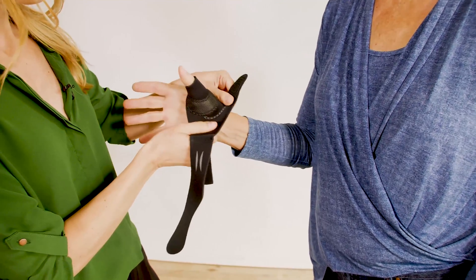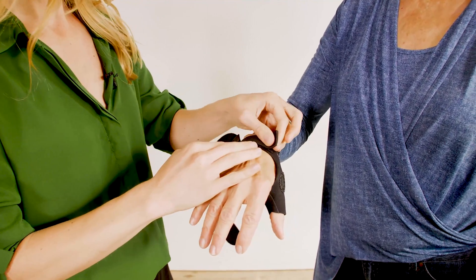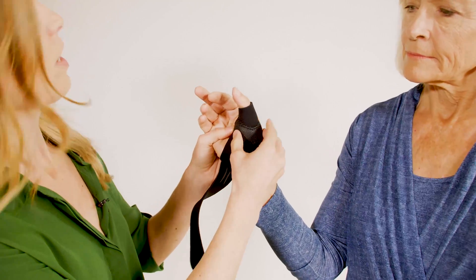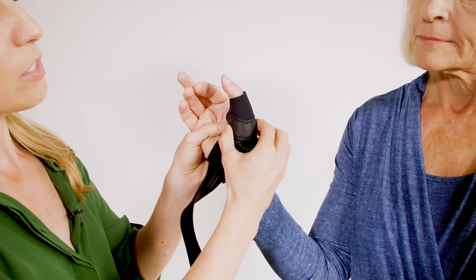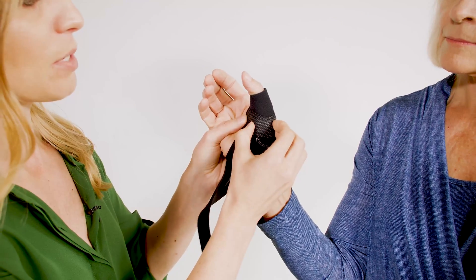Next we're just going to place the thumb into the thumb hole, and close this simple patient closure strap over the back of the hand. Then come through and give a squeeze to the stay so that it kind of hugs the metacarpal, lifting the metacarpal head for some stabilization.